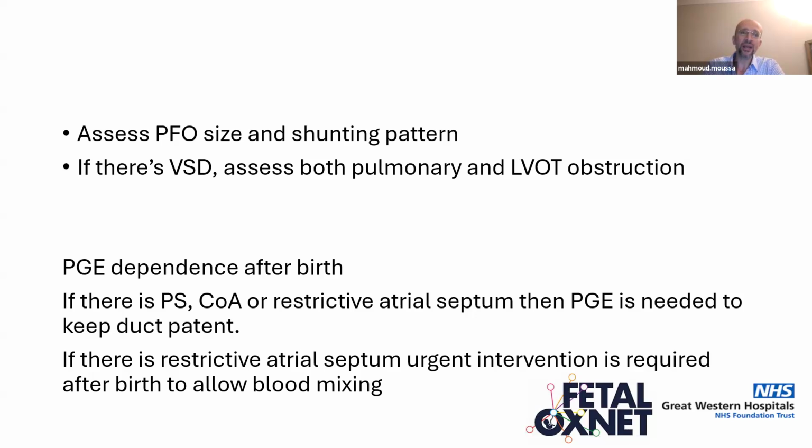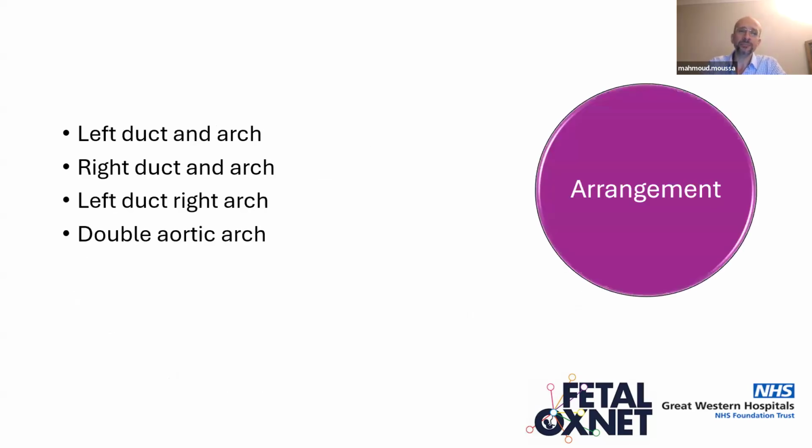So that's why it's very important to assess the atrial septum and the foramen ovale, because if there is a lot of restriction, those babies actually might require immediate intervention after birth. So that is very important as well in planning where to deliver those babies.